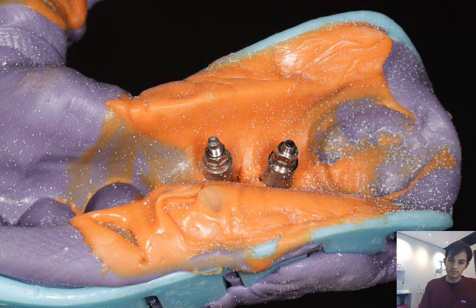If you're going to restore this case digitally, you can put one scan abutment on, scan that, take it off, put it on the next implant, and just lock out the area where your first scan is, and you can capture both separately. Even if your scan abutments crisscross, it doesn't prevent your lab tech from getting a good match of that scan data, and you don't have to go through the difficulties of trying to modify your impression copings.